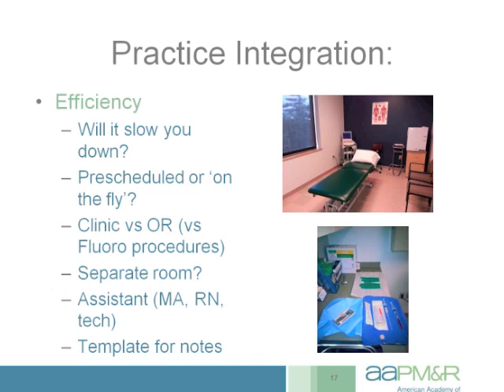In my practice with ultrasound, we really do it quite differently. Because we have a dedicated procedure room right in clinic, most of the time I'm going to do the procedure right at the time of the consultation. And we're able to do that really without falling behind because we've established some protocols and procedures, and we've done a lot of staff education, and we're able to do the procedure in a very time-efficient manner. And as you can imagine, most patients really appreciate being able to get that procedure on the same day as their office visit.